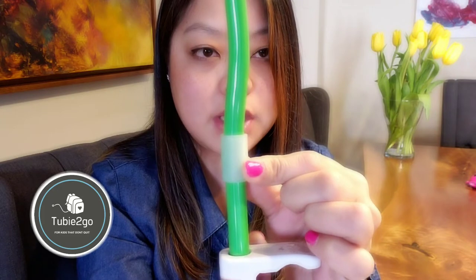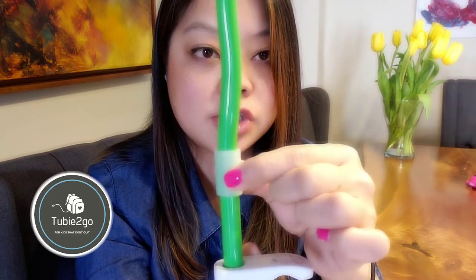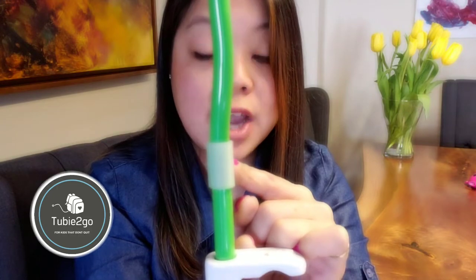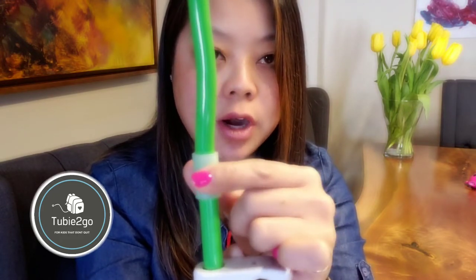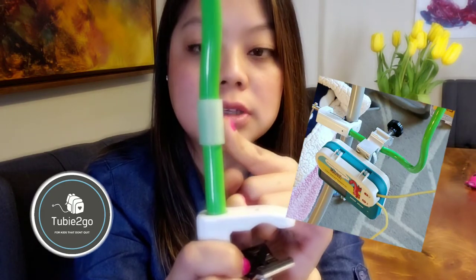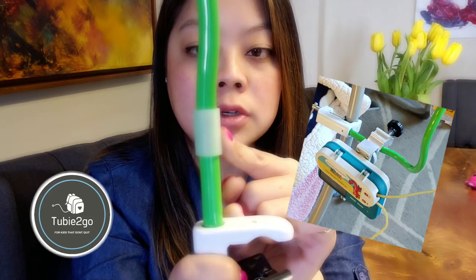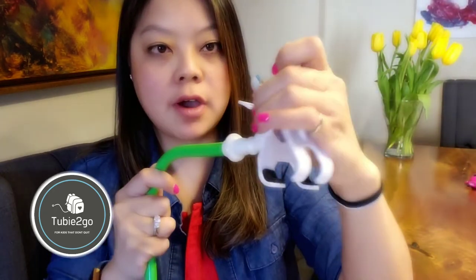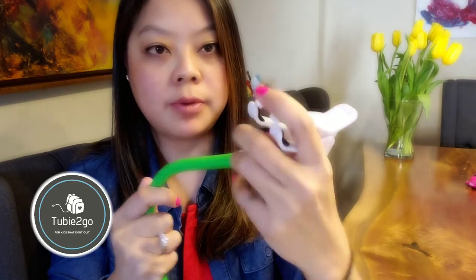The next feature is this silicone rubber part on the base of the Free Arm, which is where you can attach your pump. Normally you use the clamp on your Infinity or Kangaroo pump to attach to an IV pole — this is the spot where you attach it onto the Free Arm instead. On a cell phone holder, this particular part does not exist, so clamping onto that is not going to be nearly as secure.